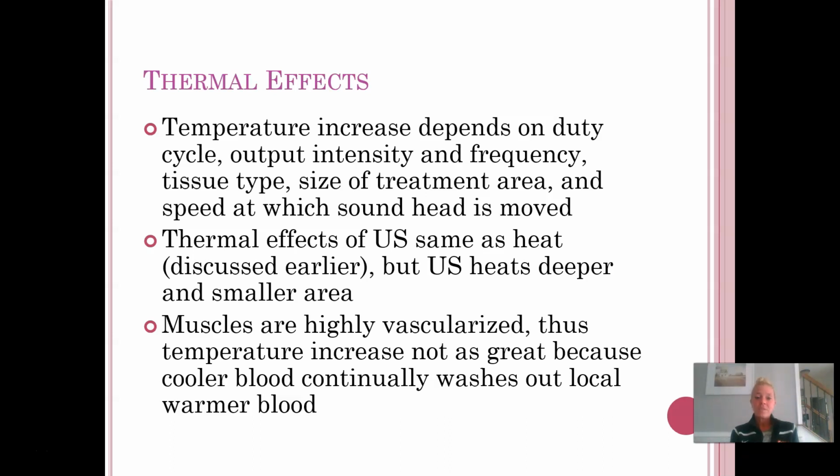Again, thermal effects of ultrasound are going to be the same as everything that we've talked about with heat, but we are going to be able to heat a deeper area. It is going to be a smaller area. Ultrasound tends to be more concentrated. Muscles, which again are typically our target treatment area, do have a lot of vascularity. So the tissue temperature increase is not going to be as great because cooler blood is going to be constantly moving through and it's going to wash out the blood that we're heating with the ultrasound.